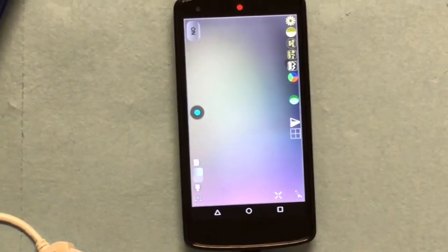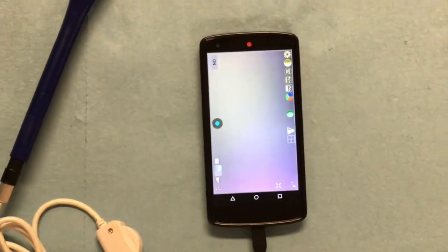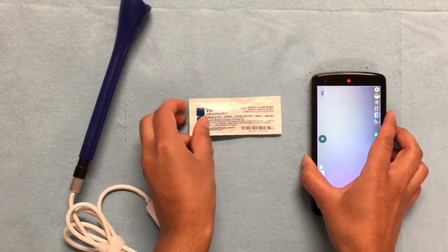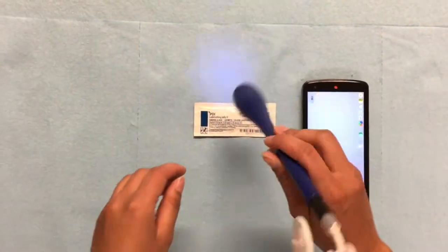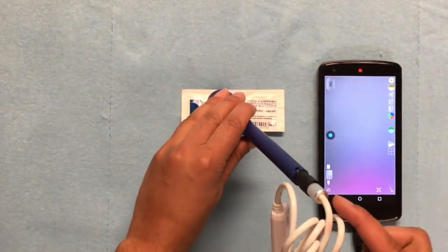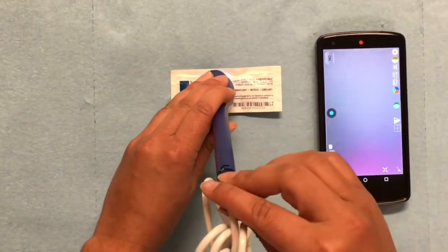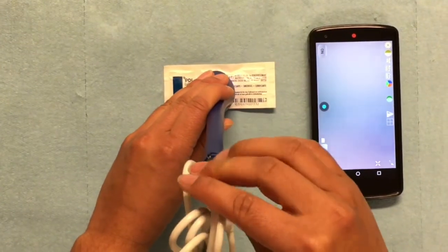Now that the settings are correct, we will adjust the camera focus using the silver knob to obtain a clear image. Place the device on a piece of text — for example, I have a clean lubricating jelly packet. Turn the camera knob until the words come in focus on the phone screen.